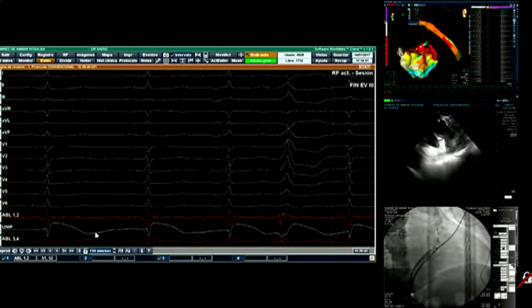I think that this is important. The only reason why we use half normal saline was because we were in the vein. When we came to the endocardium, we continued using half normal saline in order not to change the bag, because we thought that we were going to cause some lesions and see the effect. In the endocardium, half normal saline doesn't make much difference because we are washing constantly. So the only reason we did it in the last case was because of convenience, in order not to use it for 20 minutes and then change over the bag. But the key reason was because we burned first on the vein.